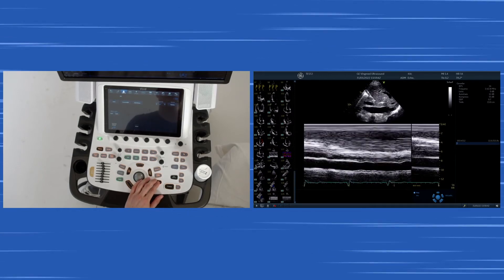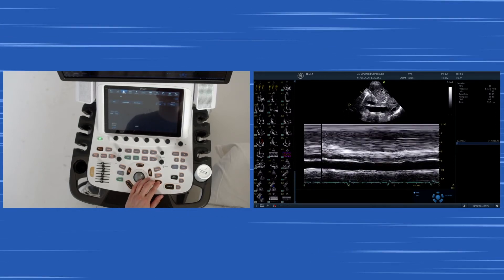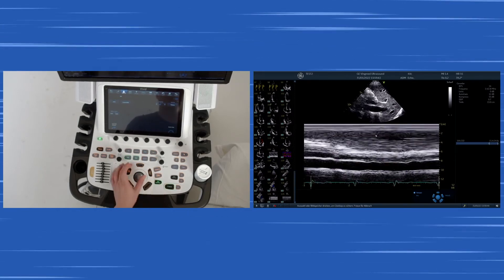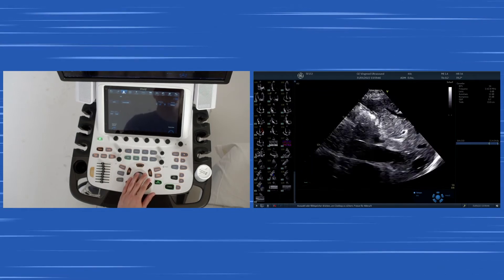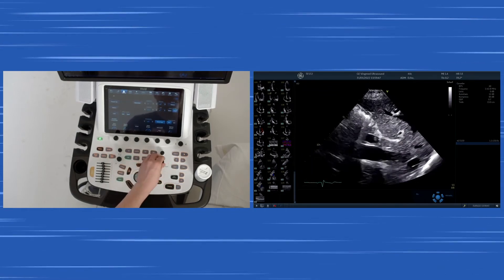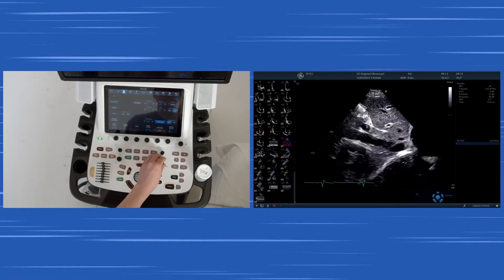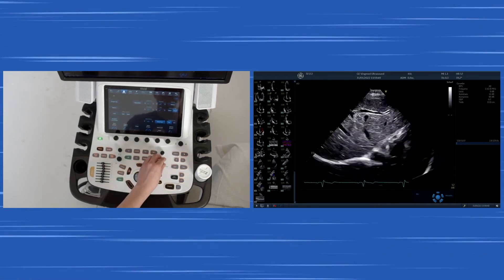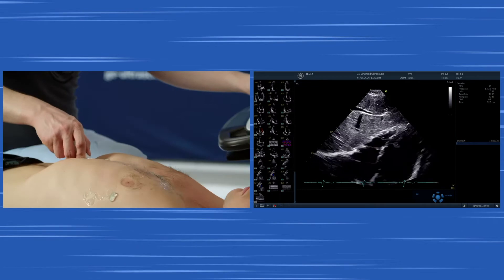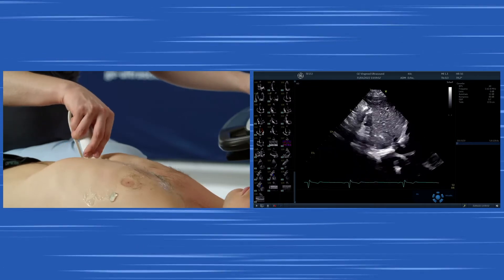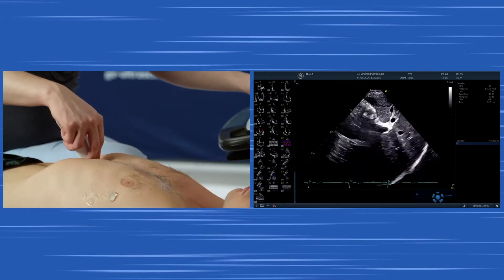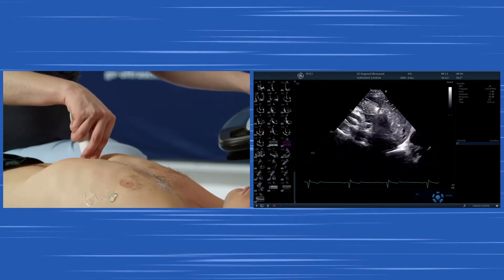As he is breathing, there is a motion of the IVC, which is absolutely normal — it should collapse a little bit during inspiration. As he is a young, healthy individual, the IVC looks rather prominent.